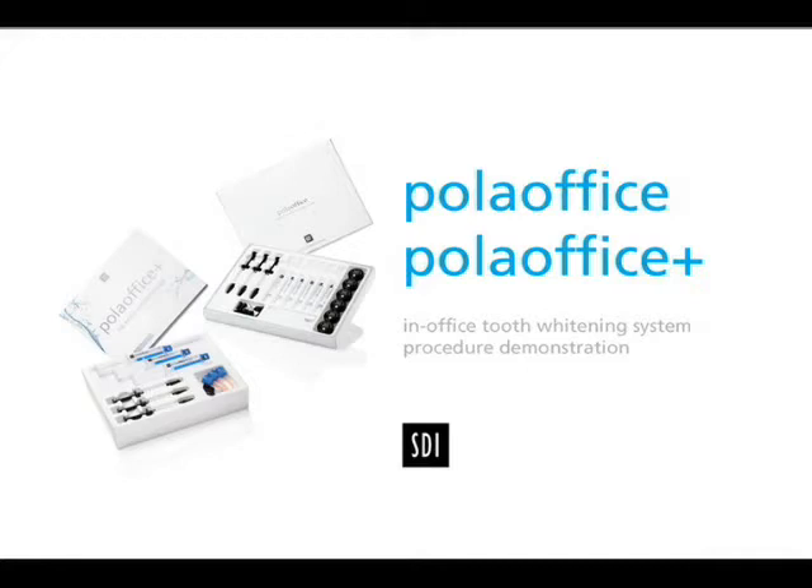Pola Office is a simple to use in-office tooth whitening system requiring minimal chair time. Whiter teeth are achieved in just 30 minutes. This video demonstrates and provides information which will assist you in preparing the patient for the Pola Office whitening procedure.